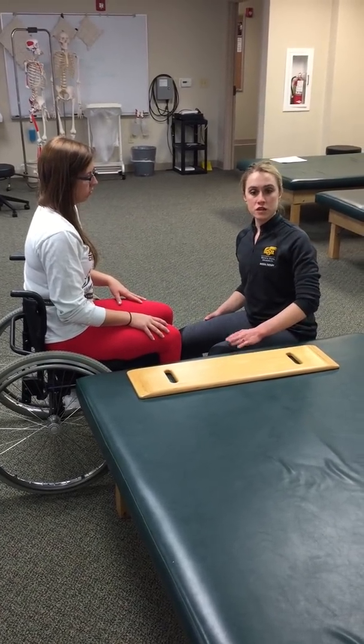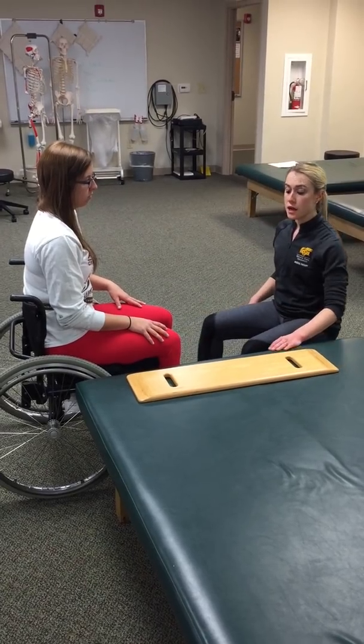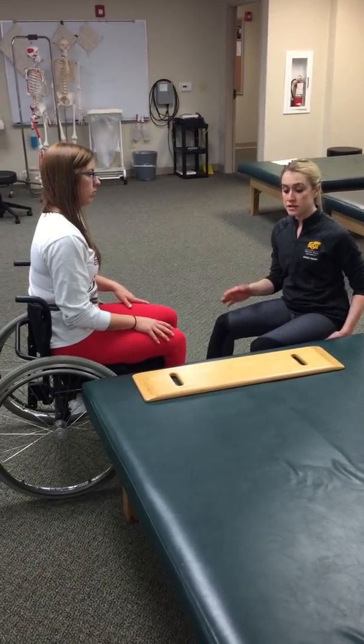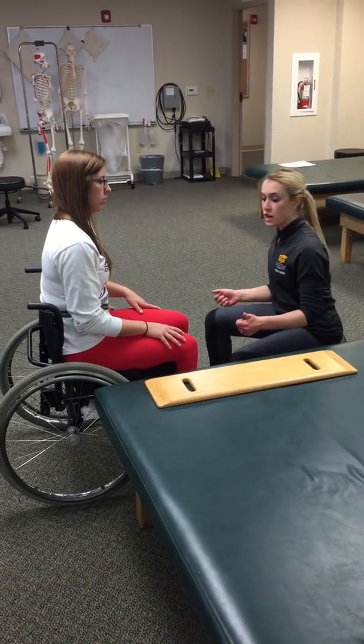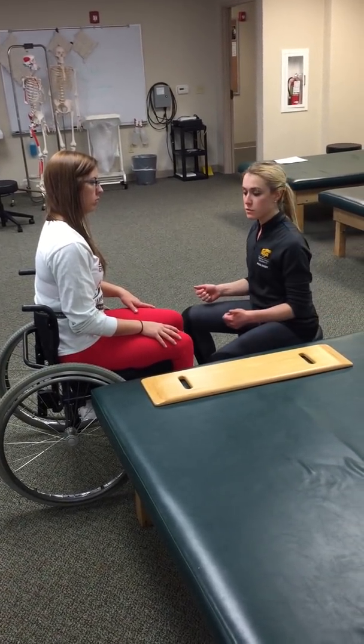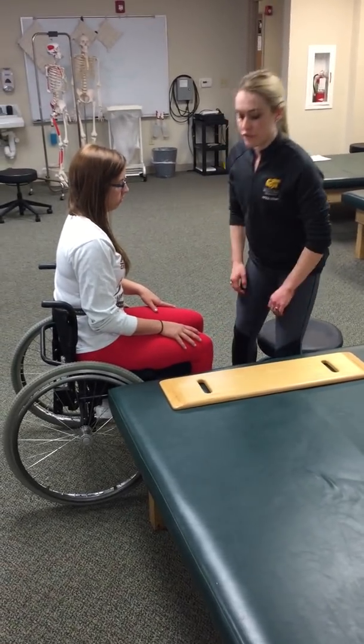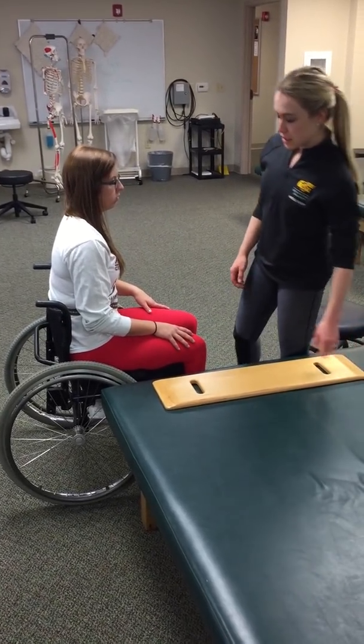I'm currently sitting on a stool, but to complete the rest, I'm actually going to stand up. This can also be done if your height compared to the patient's height or size allows you to sit on a stool. You can actually use a stool to complete the pivot portion of the transfer if you're still able to remain close to that patient's center of mass. In this case, I'm going to get the stool out of the way.